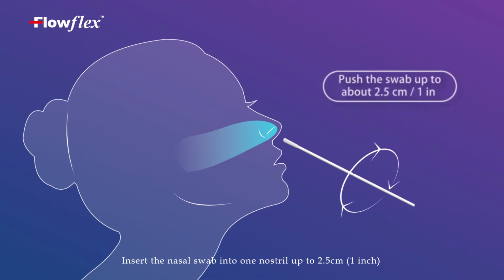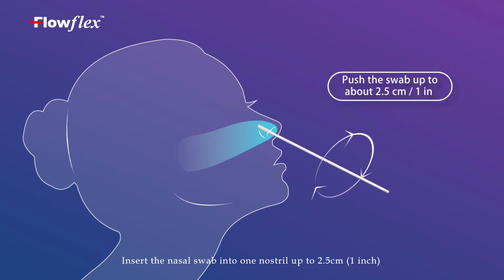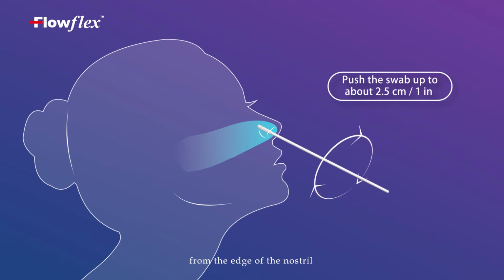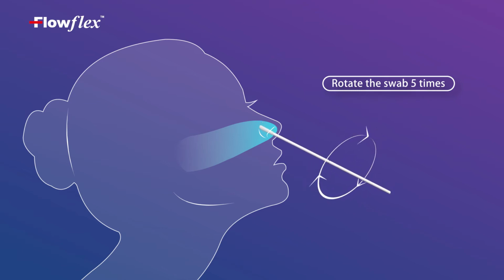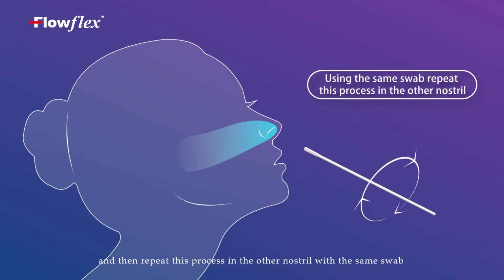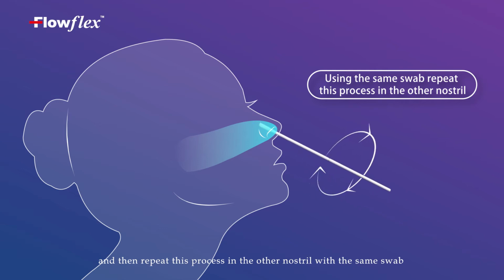Insert the nasal swab into one nostril up to 2.5 centimeters, 1 inch from the edge of the nostril. Rotate 5 times, and then repeat this process in the other nostril with the same swab.